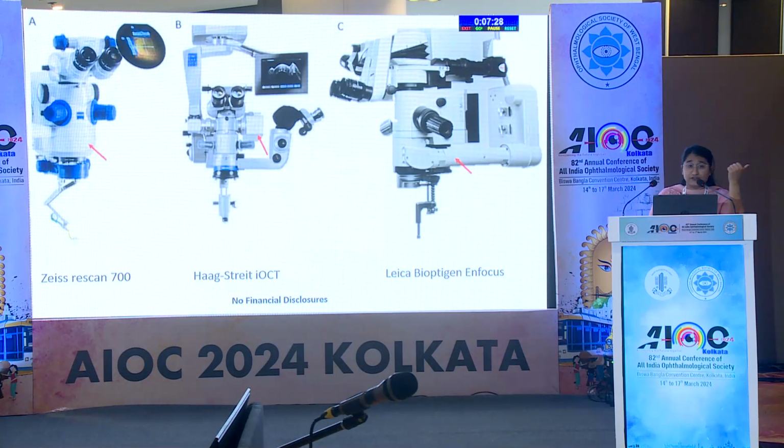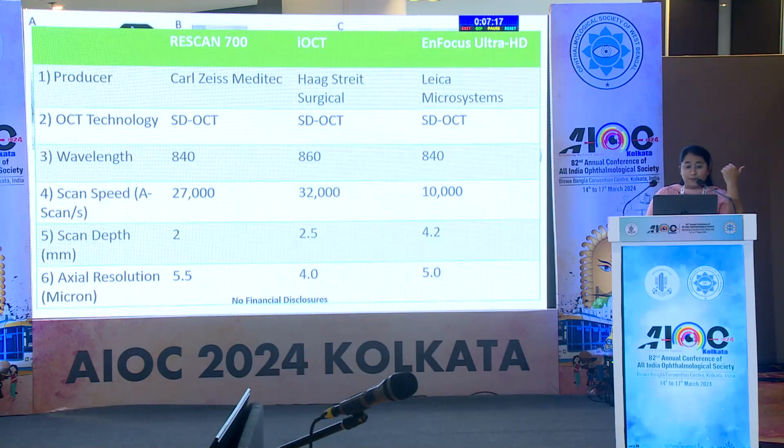Currently, I have no financial disclosures, but there are 3 systems available which are FDA approved: the Zeiss Rescan, the Haag-Streit, the Leica Bioptigen. All 3 are based on the SD-OCT or the spectral domain OCT technology.